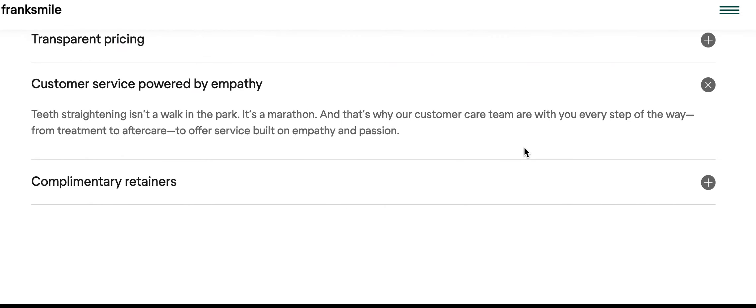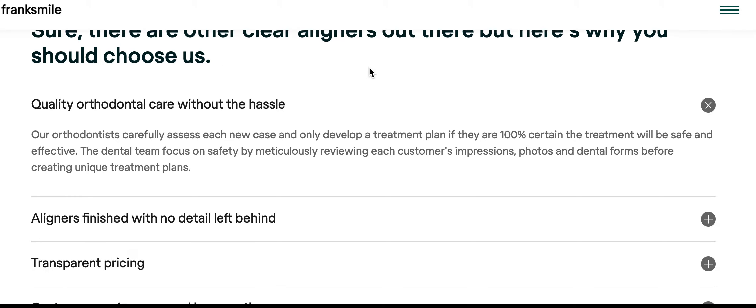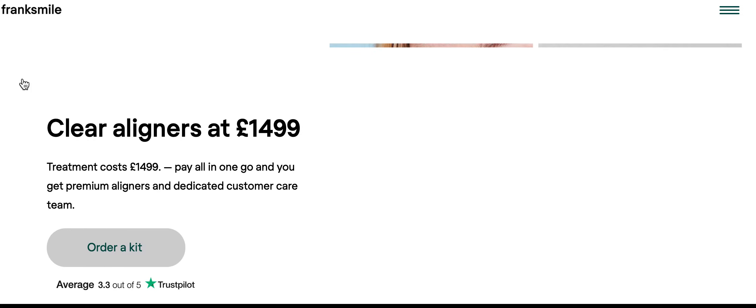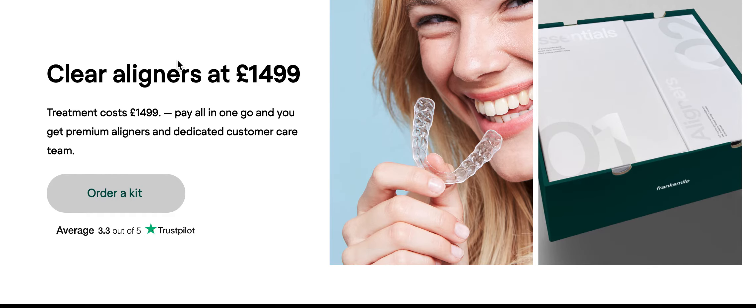Okay, that's wonderful. Oh, it comes with a set of retainers — that's nice. Let's see what else we've got going there. Pricing — I think they said it's 1,499 British pounds, which is I think around 2,200 US dollars or so. Sad here that the average rating is only 3.3 out of five.